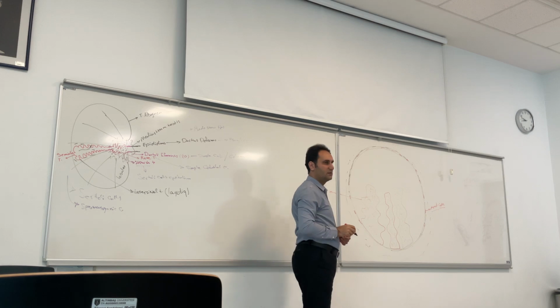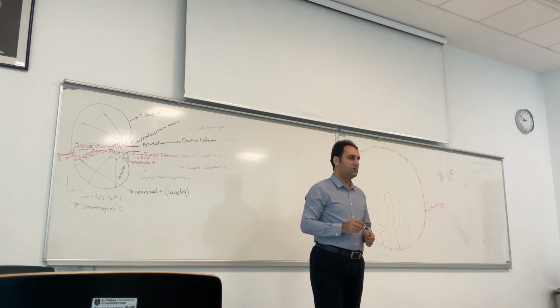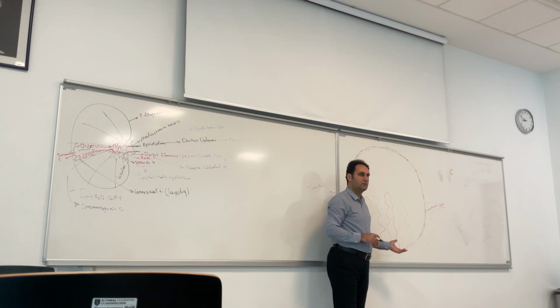What is the synonym of these cells in the follicle of the female reproductive system? These cells have a role like granulosa or follicular cells. Okay?